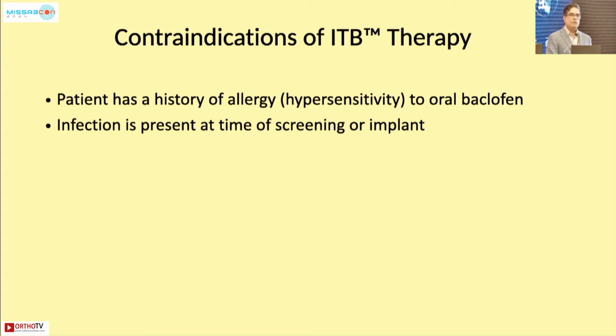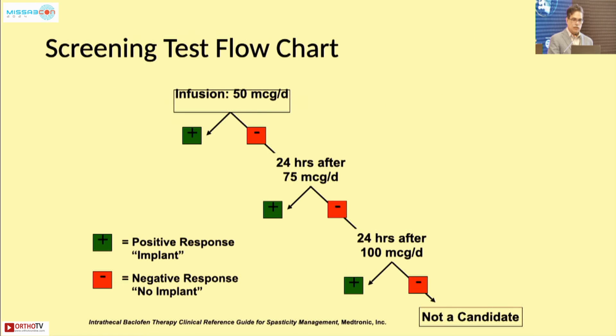There are very few contraindications, like in a patient with active infection, coagulopathy, or if there is a history of allergy or hypersensitivity to the drug itself. This is the screening protocol that I personally follow.